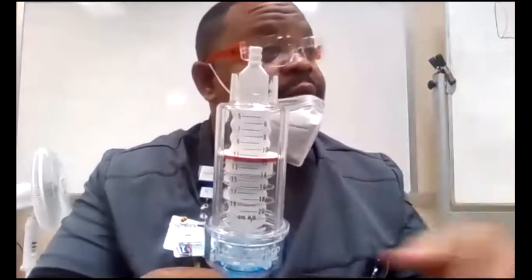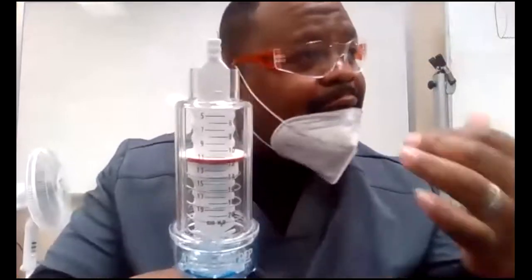It's usually 10 to 15 to start, but you can adjust that for the patient's comfort. If he can't do 15, come down off of it, okay? Because you're not getting anything done if he can't do it. So you can't be overzealous. If he can't do it, he can't do it, all right? So let's look at those on the PowerPoint.